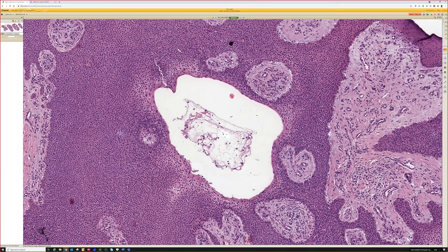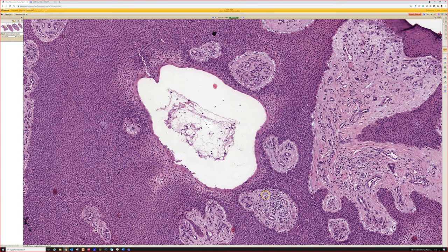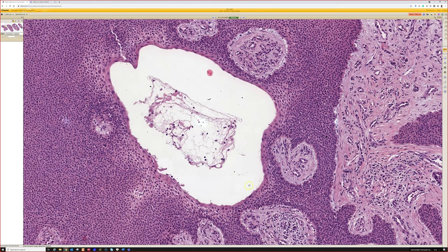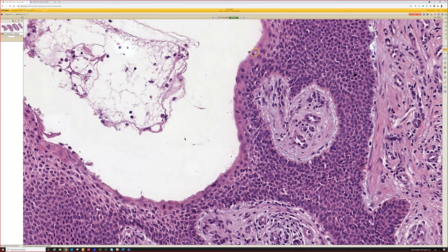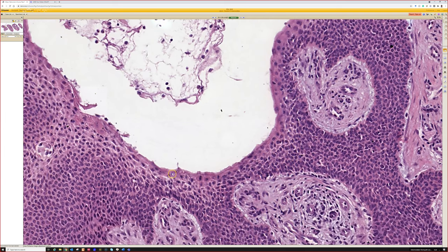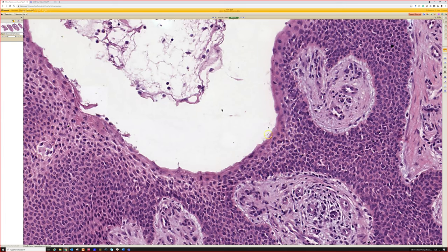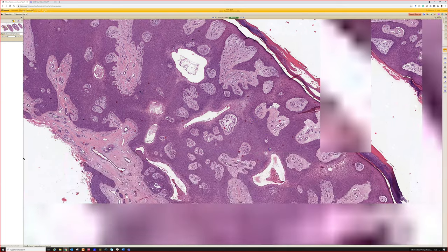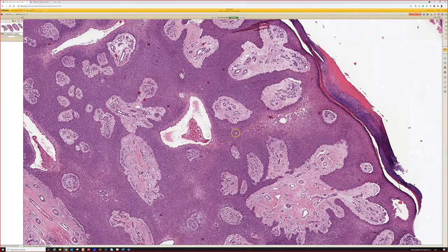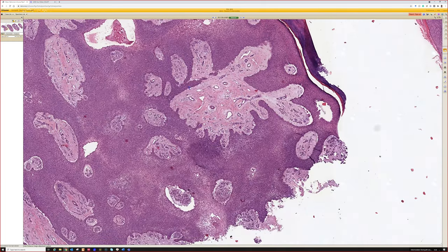If you really want, you could do an immunostain, although I don't think you need this in real life very often. CEA tends to work really well. Carcinoembryonic antigen will highlight the lining of the duct spaces. That's kind of my favorite stain to highlight ducts. The other thing is if you look closer, you can see a layer of cuboidal cells that have a more abundant pink cytoplasm lining the duct space here. So that's nice. Also, other times you'll find the little punched out lumens that have a little cuticle around them.